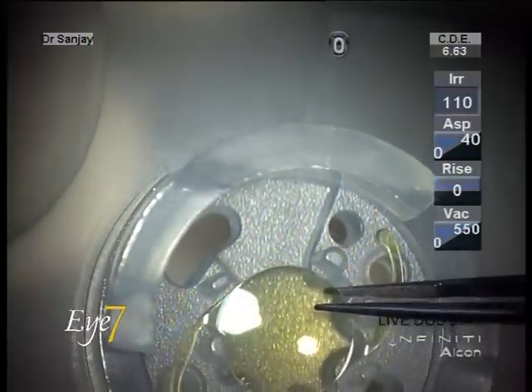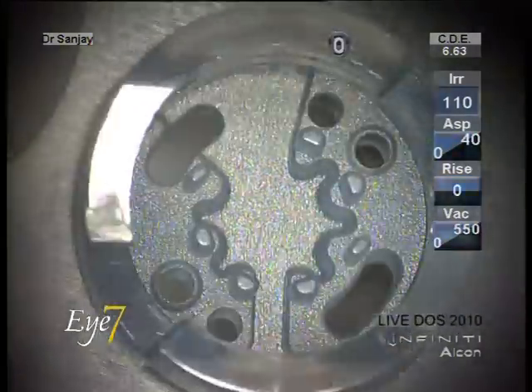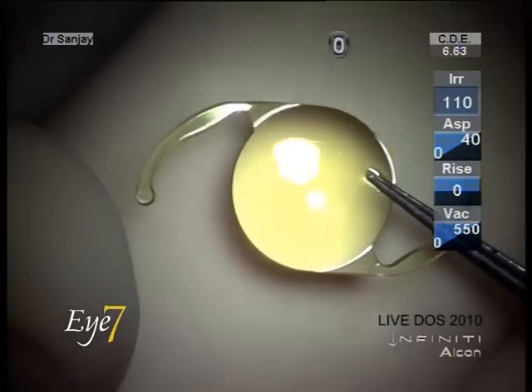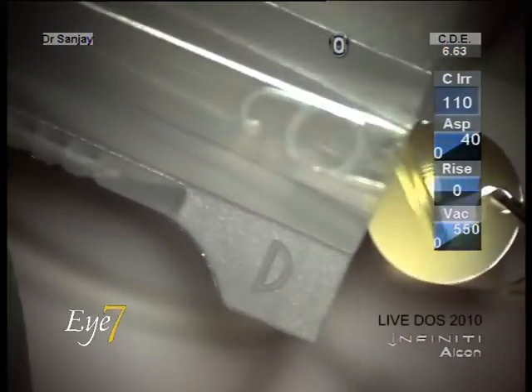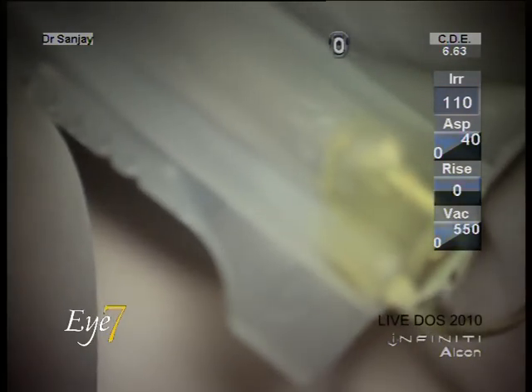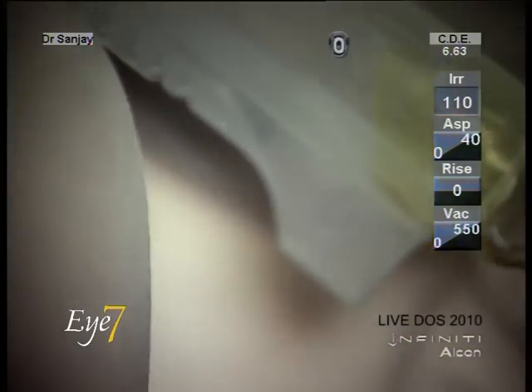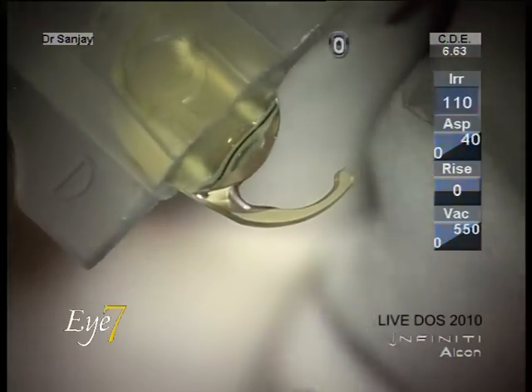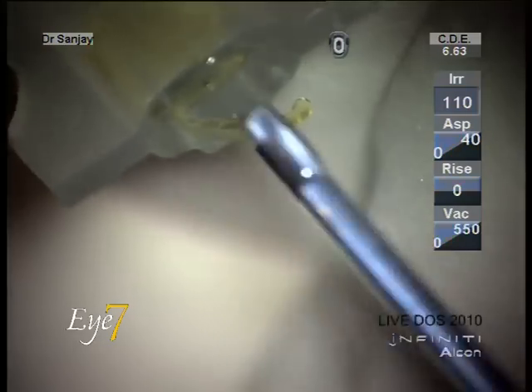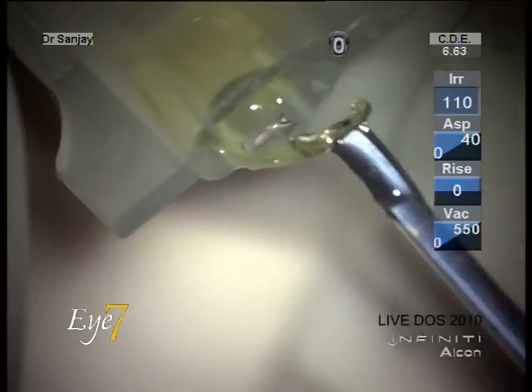This is the D cartridge and this is the position of the lens to be placed in it. This is the multifocal lens — you can see the rings in the center. The rings are in an area of 3.6 mm and impart the multifocality to the lens. The lens is designed with a plus 3 add, giving it intermediary and near focus along with distance focus.